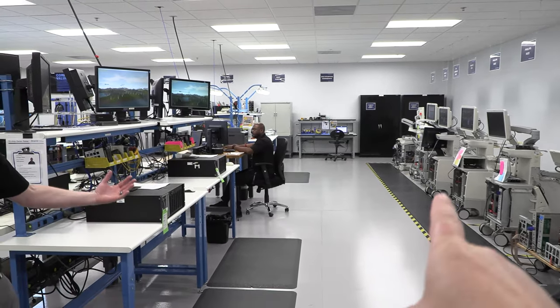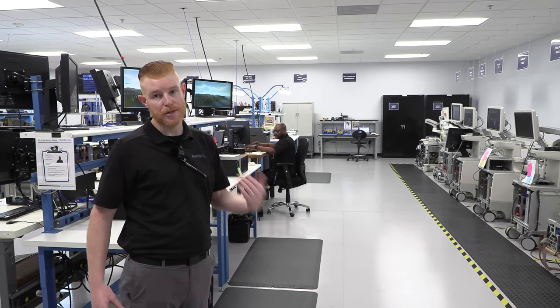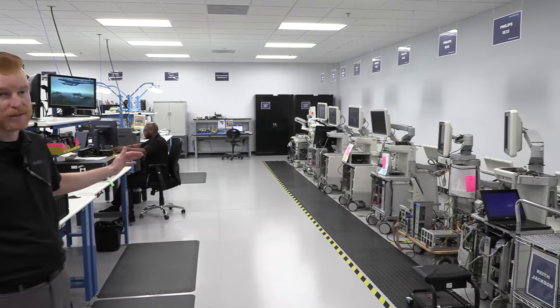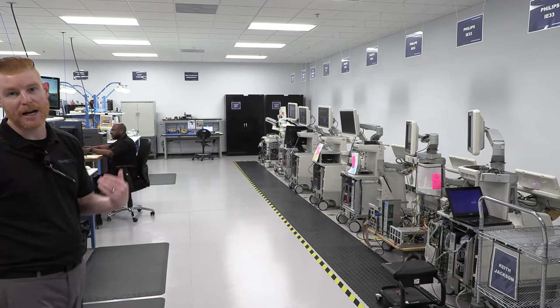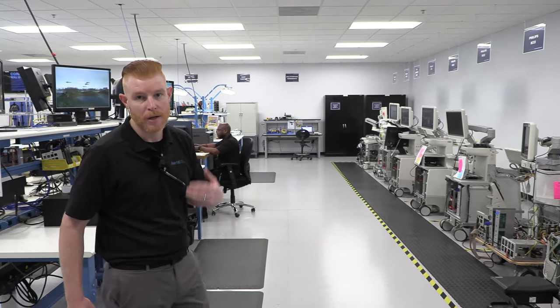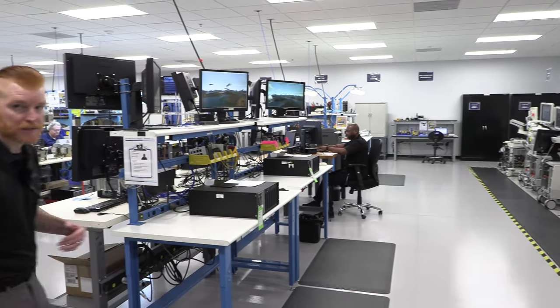As you see here, we have a multitude of test beds lined up. We made a huge investment in systems, and these are literally here just for testing PCs. So this is our PC repair area. All these are set up for ultrasound, but we also do diagnostic imaging PC repair in here as well. So we support Cath Labs, we're doing some CT work in here, so we're doing some special things in this lab.